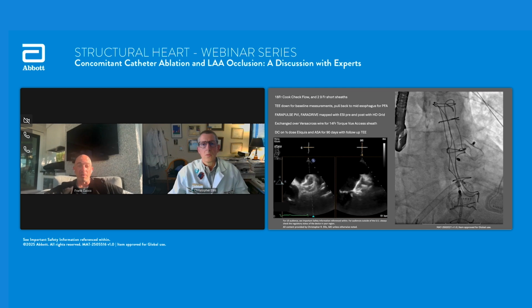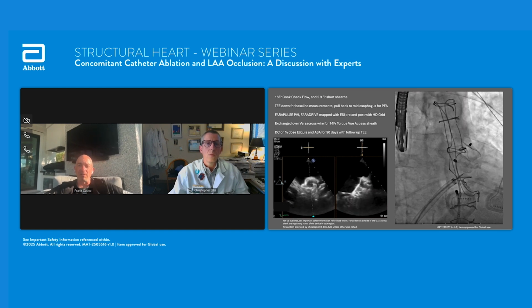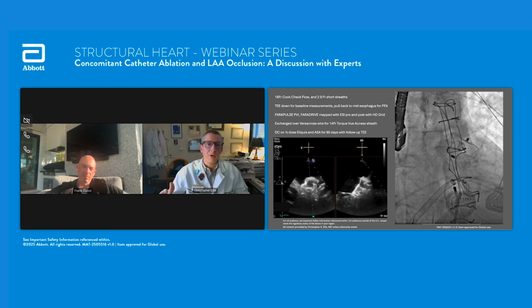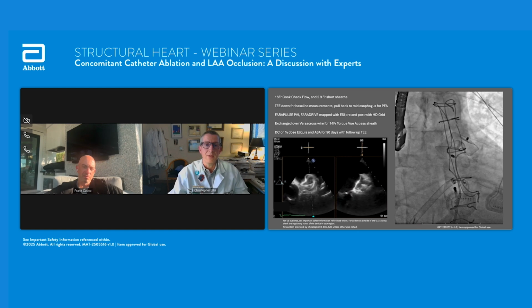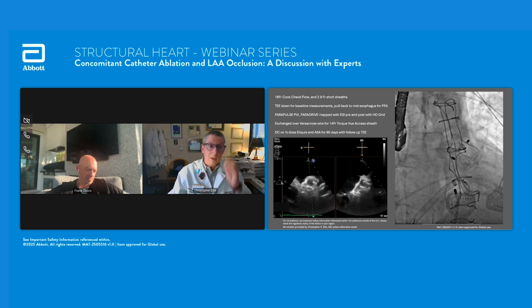Because I do find that we convert a lot of people, as you saw in your case. These atypical flutters or even AFib with a lot of substrate modification, I've never seen so many conversions to sinus rhythm as I have since we've used PFA and done substrate modification. I find that it's really great on the anterior wall flutters around the anterior side of the right superior pulmonary vein, where you can really press that catheter up into, and that's a hard area in your Bachmann's bundle to get with an RF catheter. I've seen a number of those where they've had recurrent LA anterior wall flutter, and hitting that hard with PFA did the trick, and they had a pacemaker, so I knew exactly what the AF burden was. And I agree with you on that.